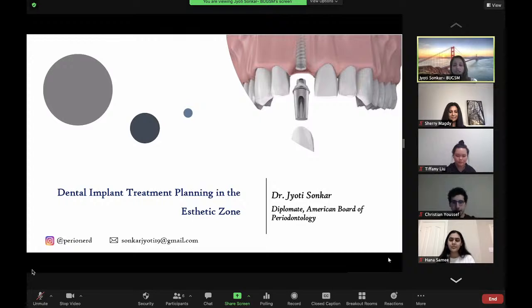Alrighty, so with this, let's start. Today's topic is a bit advanced, but it's one of the most sought after topics. I'm hoping that you know a little bit about what dental implants are and how important treatment planning is when it comes to the aesthetic area. Now, by aesthetic area, I mean the region of the mouth that shows when you smile and talk. So if anything goes wrong in the planning, it's actually out there to be seen by the world. And this is why treatment planning in the aesthetic zone gets really tricky and complex when it comes to planning the whole procedure and executing it.